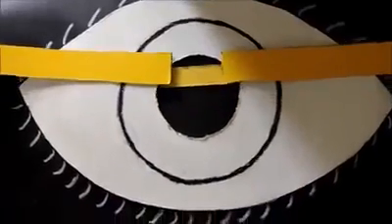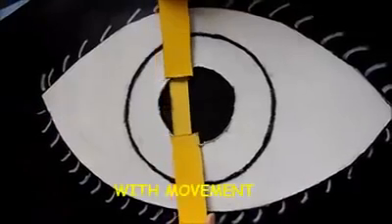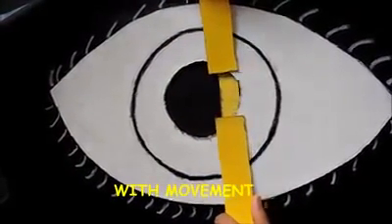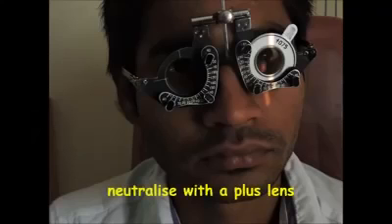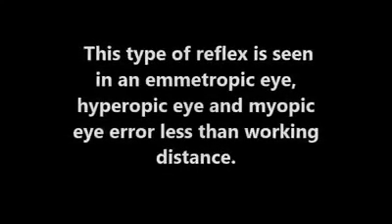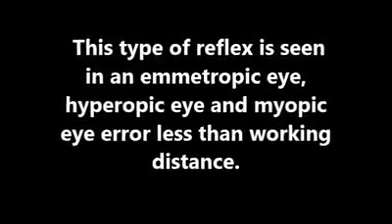Now, we check for the movement of the reflex, vertically as well as horizontally. If the movement observed both horizontally as well as vertically is a with movement, that is, the pupillary reflex moves along with the streak of the retinoscope, we neutralize this type of reflex with a plus lens. This type of reflex is seen in an emmetropic eye, hyperopic eye, and a myopic eye which has an error less than that of the working distance.